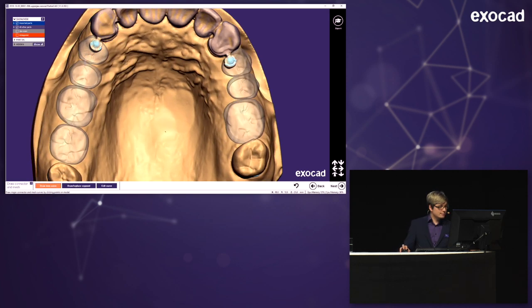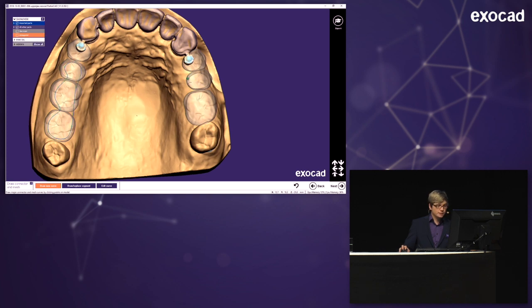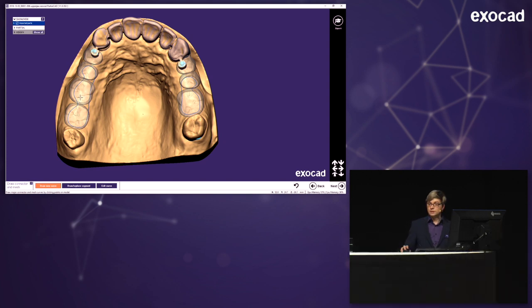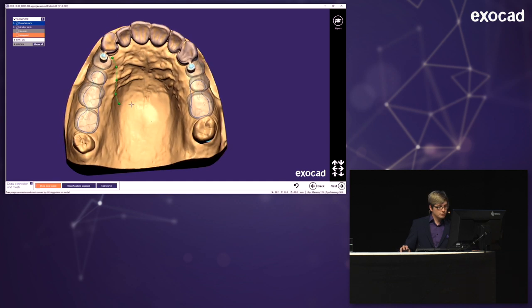So I'm drawing first some retention meshes, only on those parts here, because this tooth and this one will become metal dummies later on. So just like this, and the other retention over here. And now I'm drawing the big connector. I could also draw some metal stops in here, but I don't need them in that case. The major connector should, I guess, look something like this.